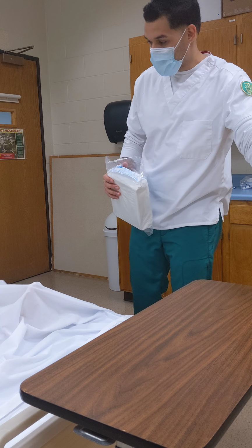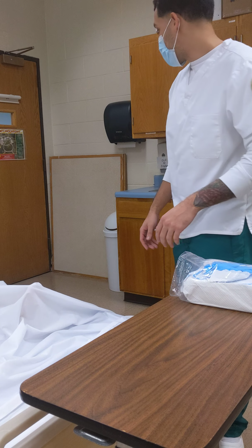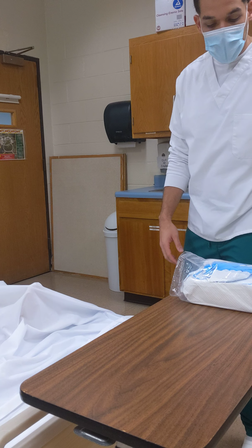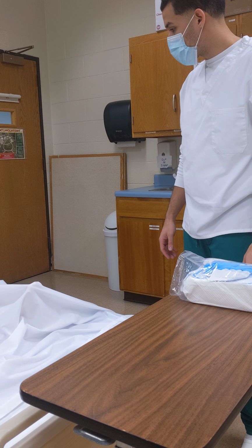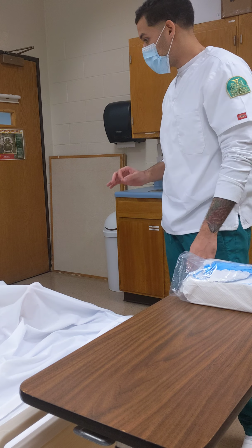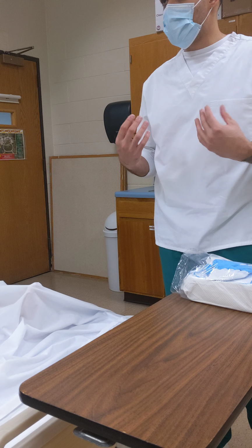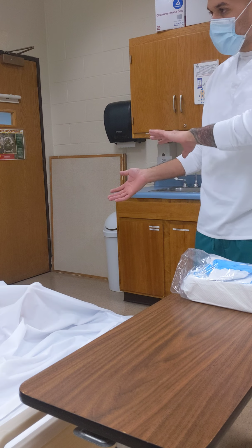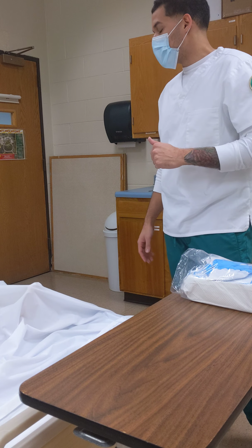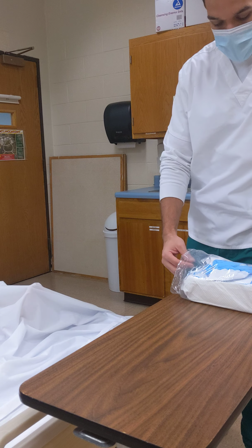I'm going to make sure my table is clean. Place my materials here. I would usually have a bath blanket, but I guess we don't for right now, which is fine. You can verbalize. I would get a bath blanket to help provide more privacy, so that the patient is also warm and covered and feels more comfortable.